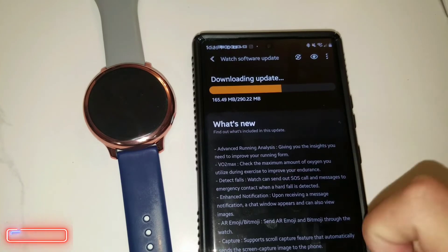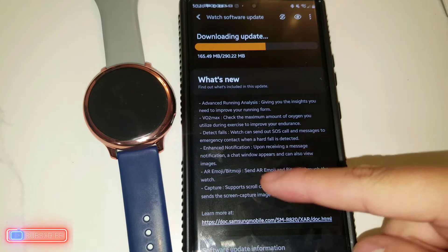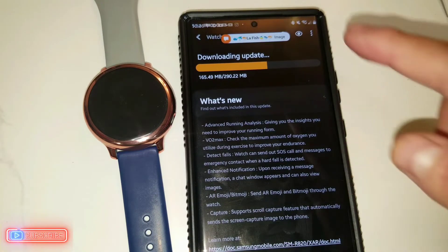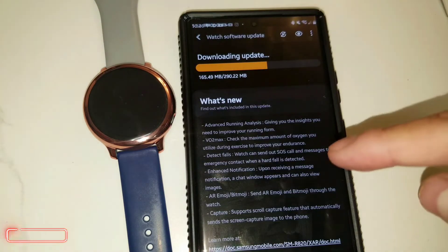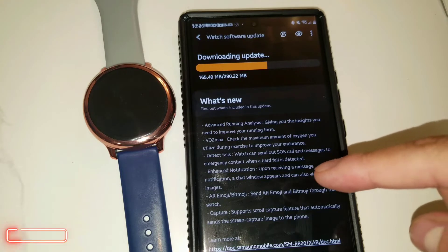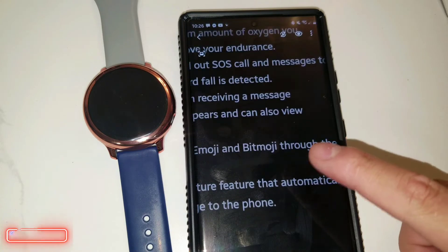It gives you a link to find additional information. But the main focus here is that we finally got the update on this watch that was initially advertised back in 2019, and it has finally arrived. Here is the new update which enables the ECG — this is the official update.